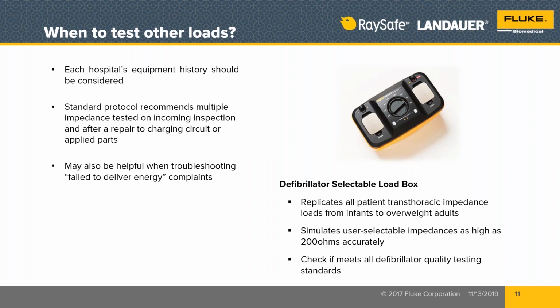So we say there's typically 3 different situations where you need to be able to do this testing. Some manufacturers require that you do this testing as part of their service manual procedure, but you should do this testing as part of your acceptance or incoming inspection test for any new defibrillator that's coming into your building before it goes into clinical use.